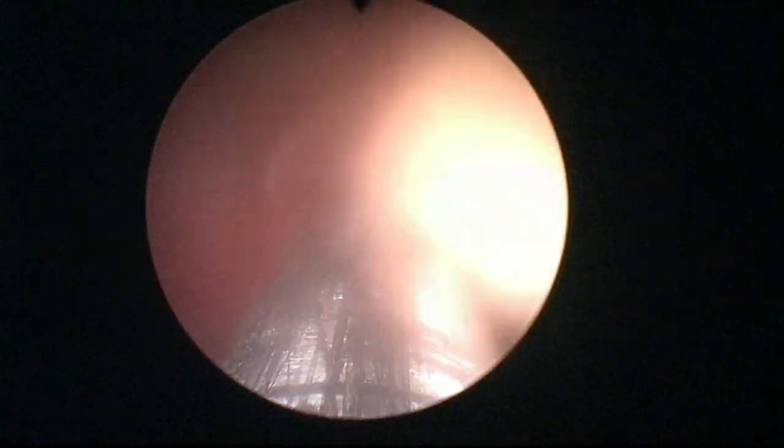It's important, as a surgeon, to know how to use the morcellator and all its subtleties. If you're going to buy a morcellator, make sure that the company tells you everything about the device, what could go wrong, what could happen, because when you are at this moment in the operation where the bladder is distended and visibility is falling slowly, you don't want to spend a lot of time trying to pinpoint what's going on with the morcellator, why doesn't morcellation work, you know?